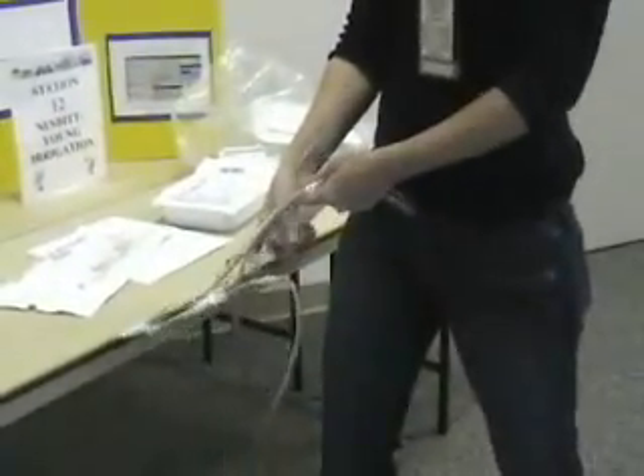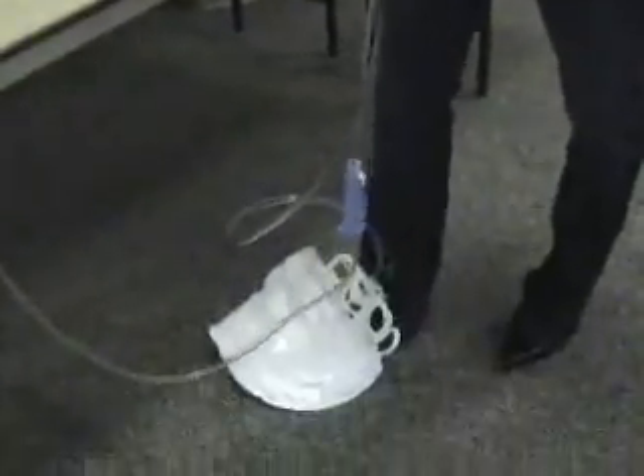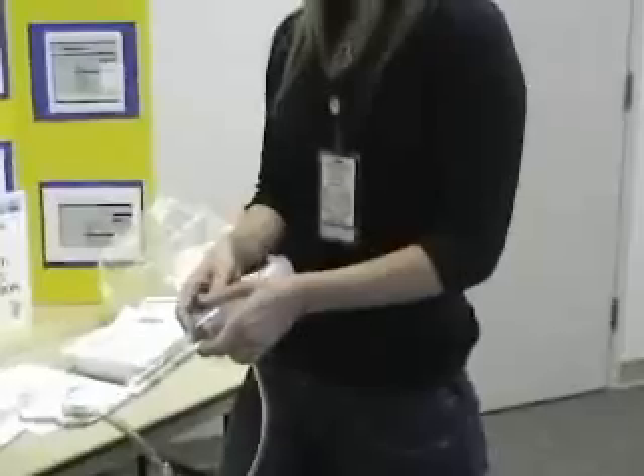Once you're done, you're going to release the clamp and let everything flow — all of this is what's coming out of the bladder into the actual bag. You're going to make sure you see what color it is and how many clots, and you record that in your charting so the doctor knows if it's really cloudy or not. Usually you go by small, medium, or large clots. If you feel like you need to do it again, you can. Your goal is that it's usually pink, yellow, or clear — you don't want any clots at all. Usually the doctor has an order of how many times he wants you to irrigate, but typically you irrigate every four hours or PRN for clots.